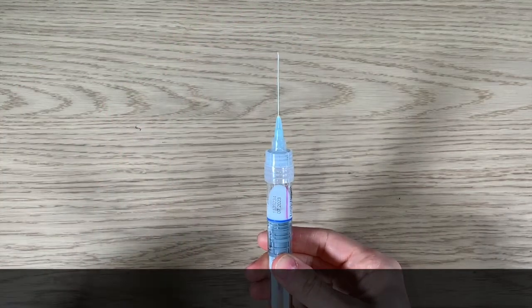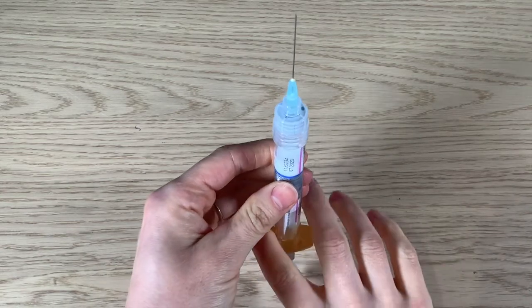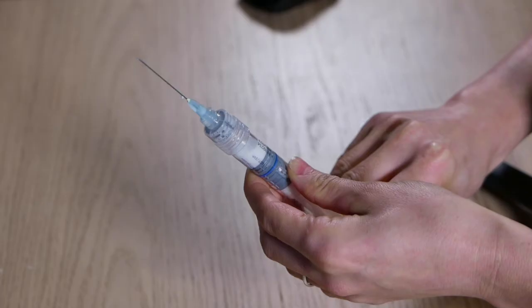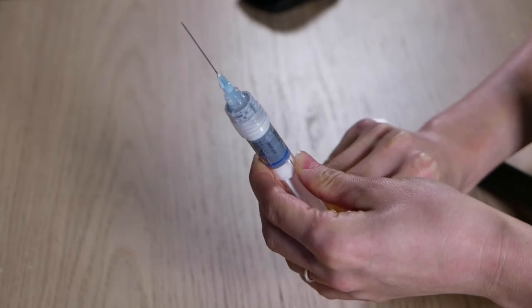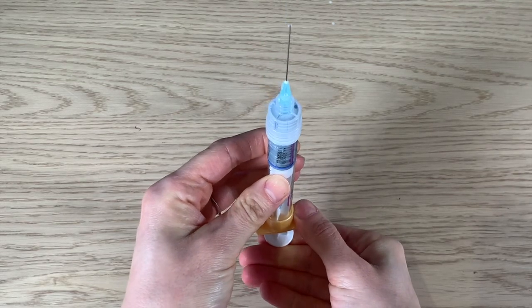Next, remove the needle housing and gently expel all the air from the syringe, holding the syringe vertical for this. When a few droplets of fluid are ejected, you can give the injection by deep intramuscular injection.